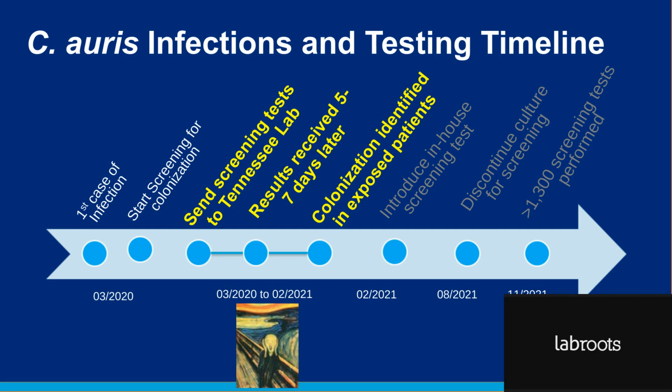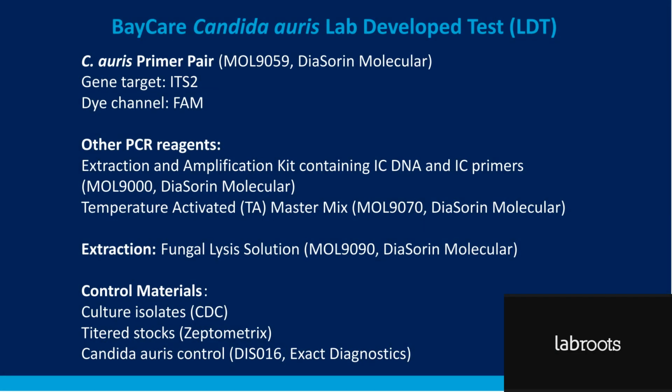We decided that we needed to move on and start looking at molecular methods inside our own central core laboratory. We ended up developing a laboratory-developed test, and we had already quite a bit of experience with ASRs, specifically ASRs from Diazorin, as well as other vendors. And we looked at our options, and we decided that this was a good combination of reagents available.